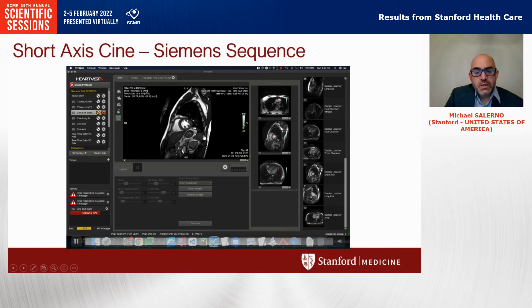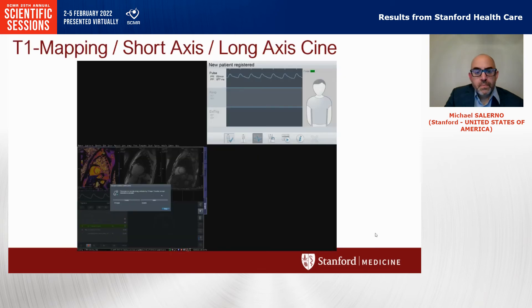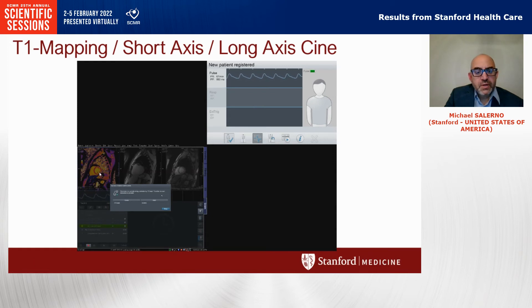We'll see the next CINE is going to appear here on the scanner in the HeartVista framework. When we look at this on the scanner, because of the Siemens sequence, it shows up as if it was run natively. This is the last image from the short axis stack.